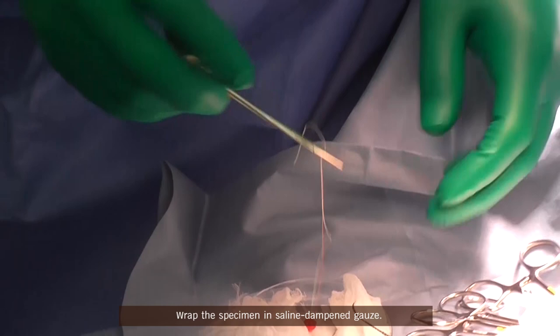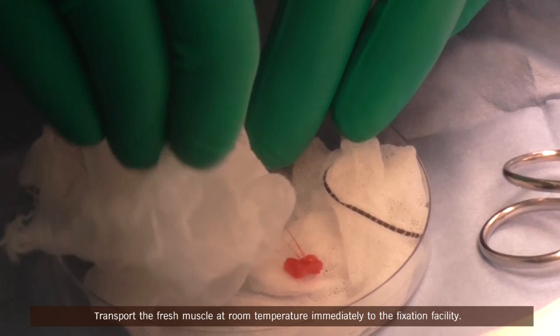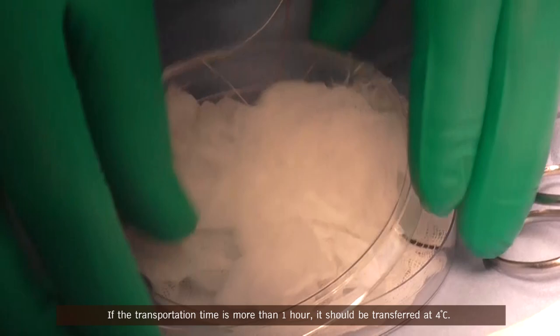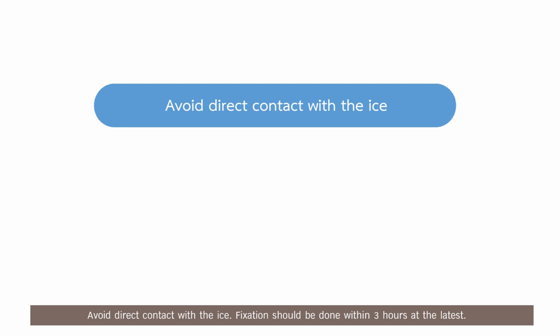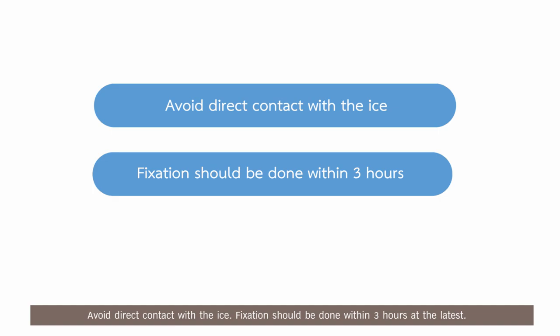Wrap the specimen in saline dampened gauze. Transport the fresh muscle at room temperature immediately to the fixation facility. If the transportation time is more than 1 hour, it should be transferred at 4 degrees Celsius. Avoid direct contact with the ice. Fixation should be done within 3 hours at the latest.